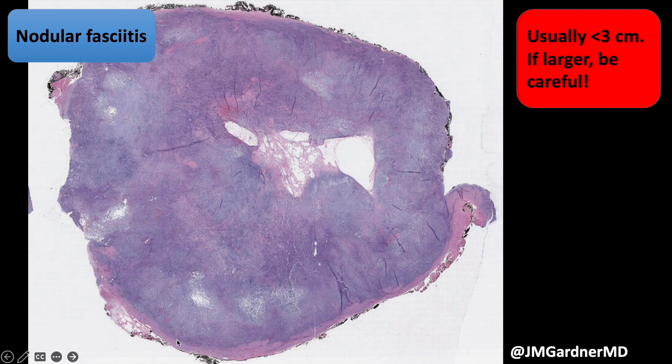Nodular fasciitis often arises off a fascia — you can see a strip of dense regular pink connective tissue; that's fascia, tendon, or ligament. The tumor can either push up into the subcutis, push down from the fascia into the muscle, or track along the fascia in a linear, spiky, stellate pattern — the so-called fascial pattern of nodular fasciitis. Those can be trickier to recognize, but usually it's a nodule pushing either up or down from the fascia.